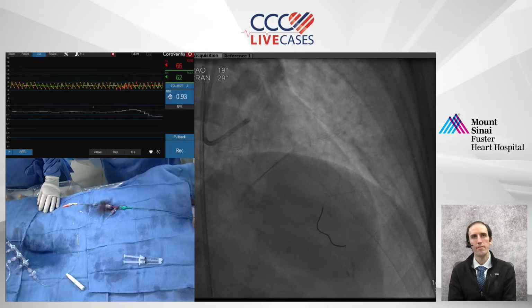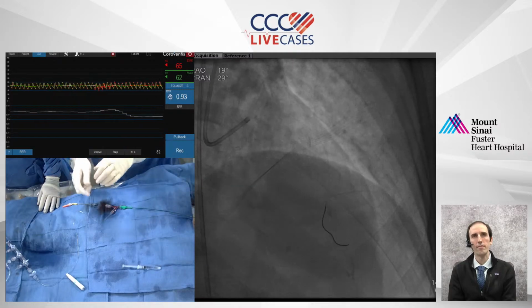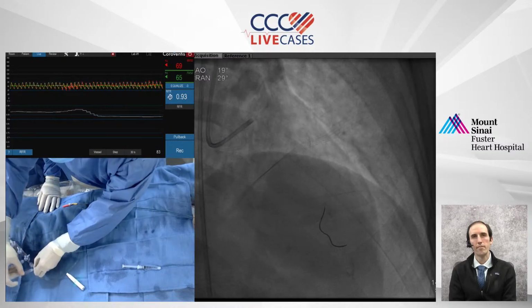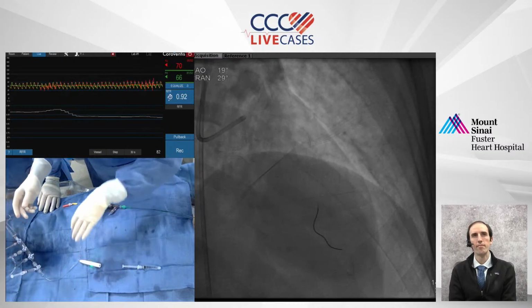Now, I mention this because one of the things that we run into is wire drift, not the physiological wire drift, but physical wire drift, when the wire drifts down or up. You can run into problems because obviously your duration of time, transit time, is going to be longer.